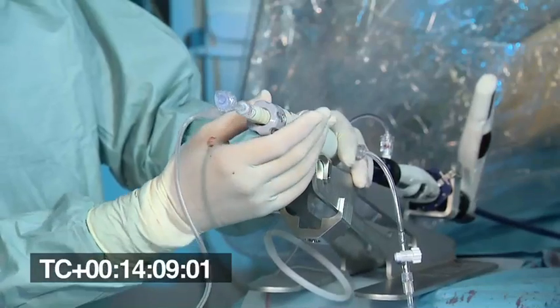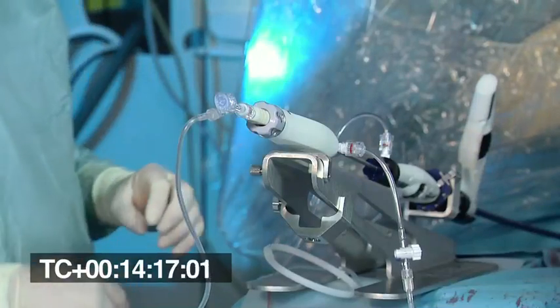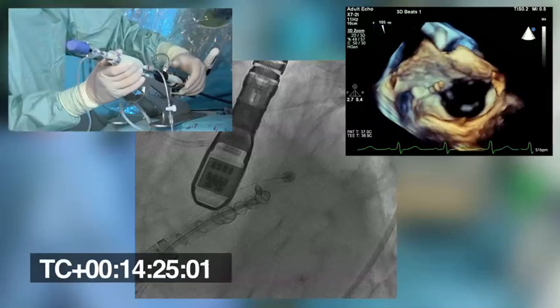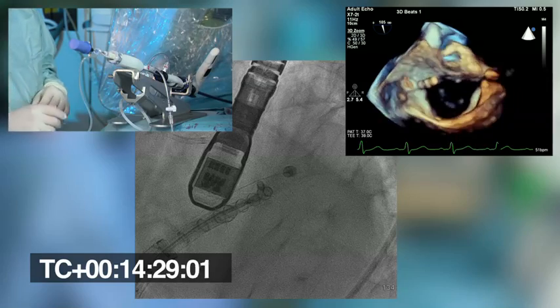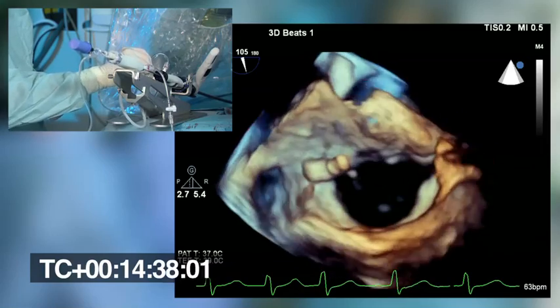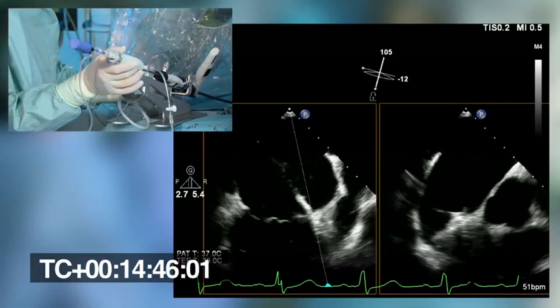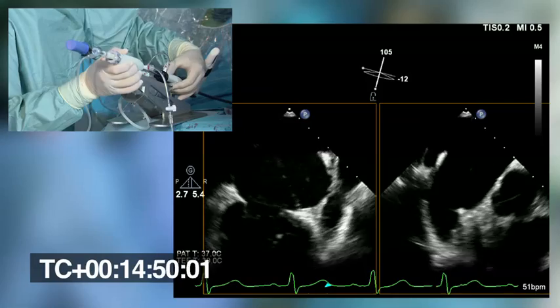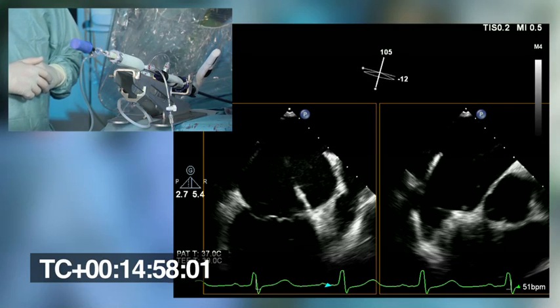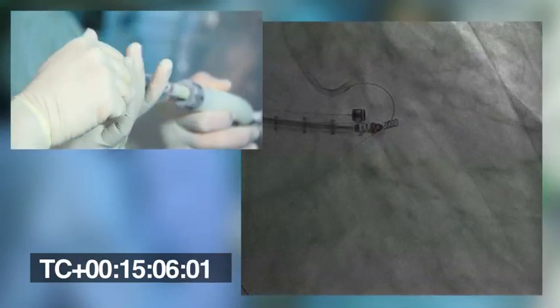We see PVCs and the advancement of the first anchor. Going back to the MFAS view you can see we are far from the circumflex — no reason to do any injection. To control the first anchor location and penetration into tissue: the spool is in contact with the tissue and now I do the pull test. As I pull, the guide catheter goes forward, which means we have a very good position and implantation. I can also check on echo pulling on the tissue. We are very happy with this implantation.